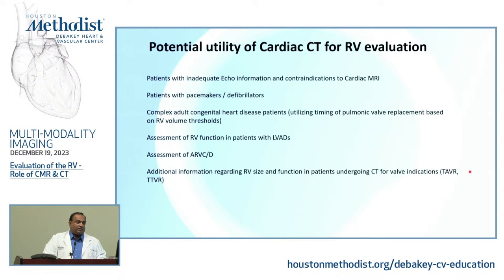Another indication is assessment of RV function in patients with LVADs. We will talk about that. Assessment of ARVD, CT can play a role in that, and I'll show an example of that. And then additional information regarding RV size and function in patients undergoing CT for valve indications like TAVR and TTVR, and I showed you some of the outcome data, which can contribute to further clinical decision making from the reports. So we always give it in the reports.